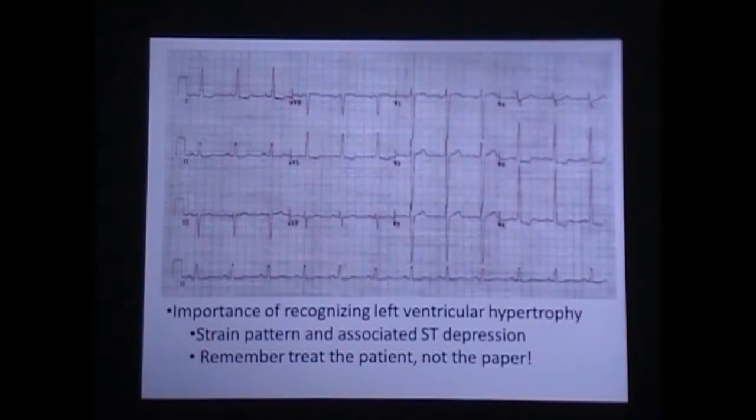Yeah, did they talk at all about the concordance or discordance piece of this too? I didn't. That's a newer concept some people have been talking about now, is it concordant, discordant, and the chances of it being bad or not bad, basically. Right. And this is one of those places where axis can come into play, but I didn't include it. And I will say that I'm weak on axis. Okay? Well, I will admit my faults and my deficits.